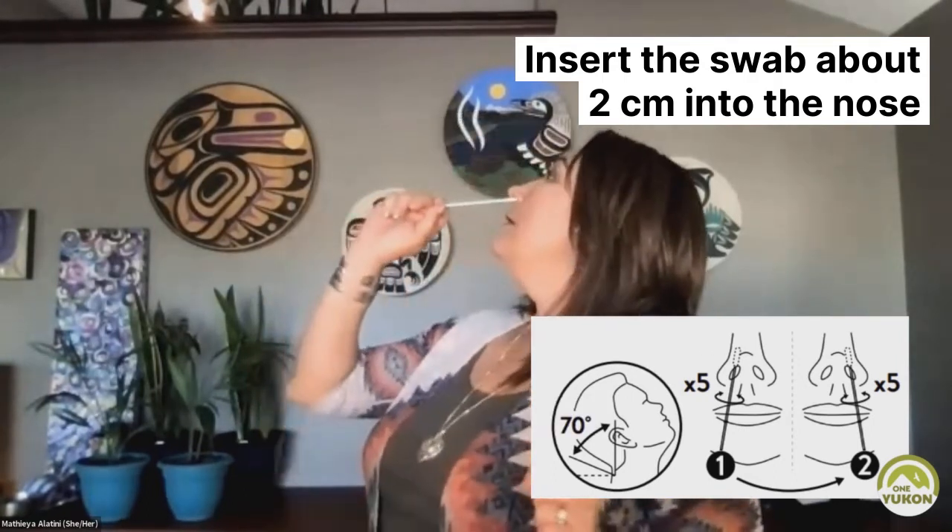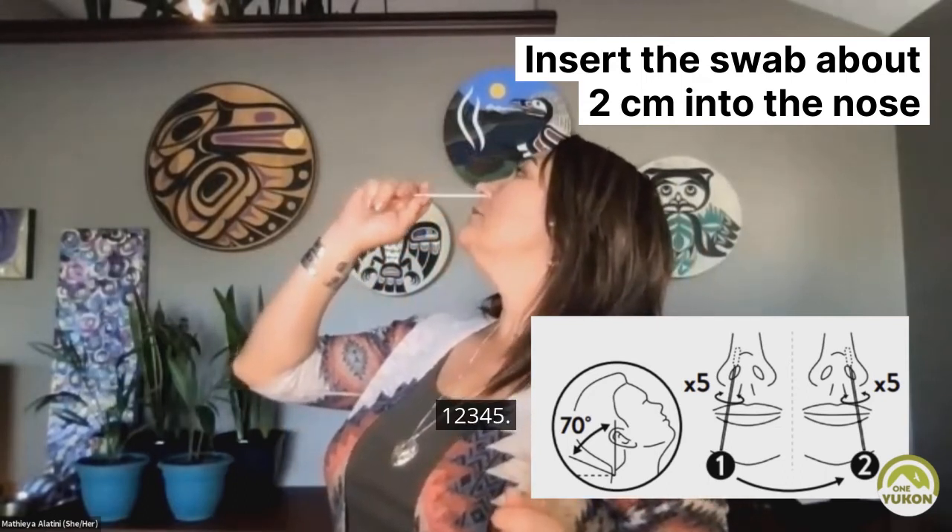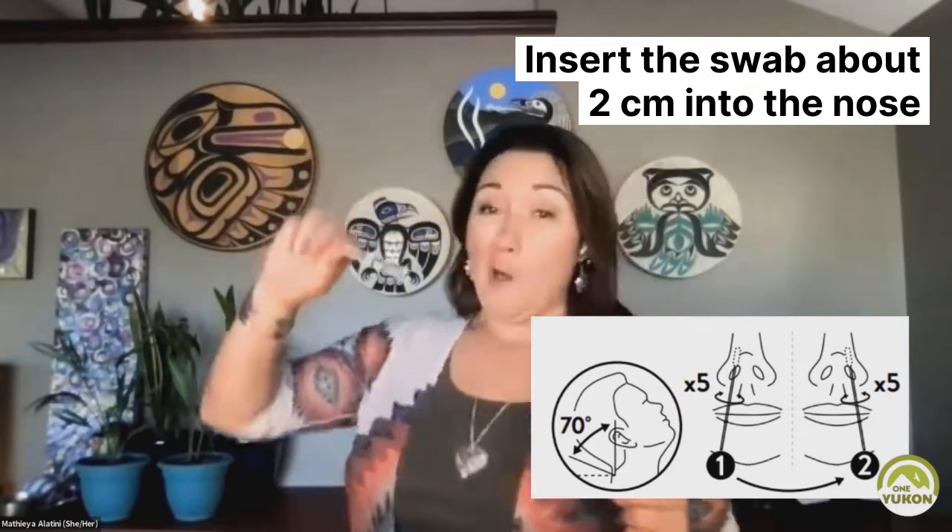Other side. One, two, three, four, five. Nice sample.